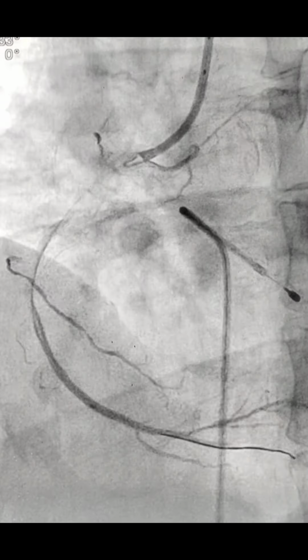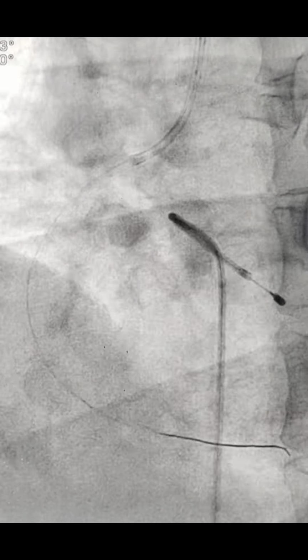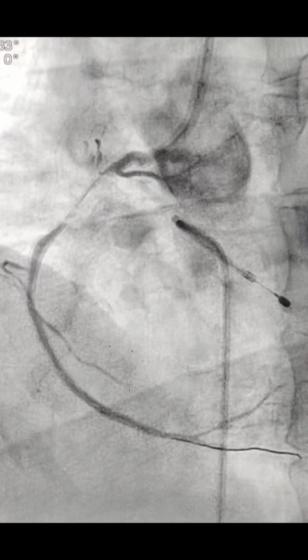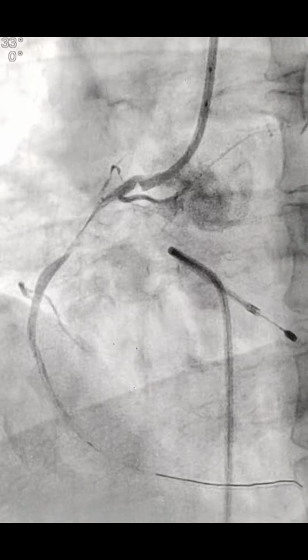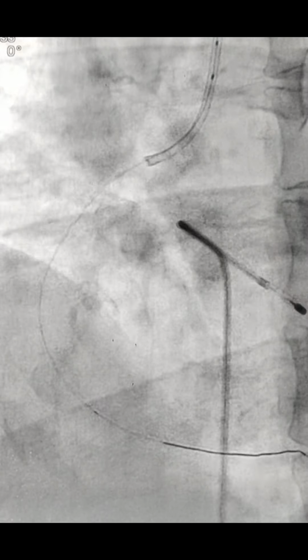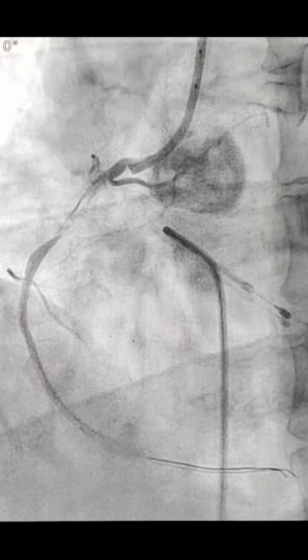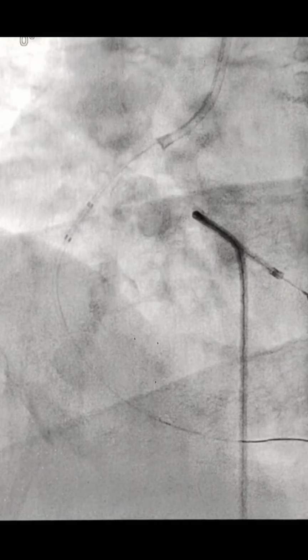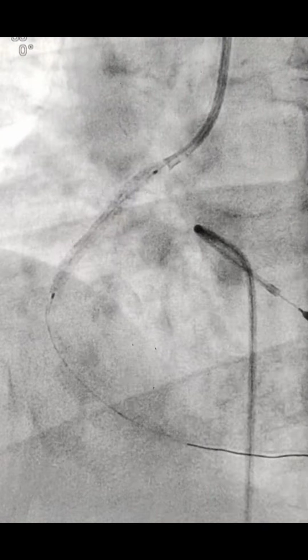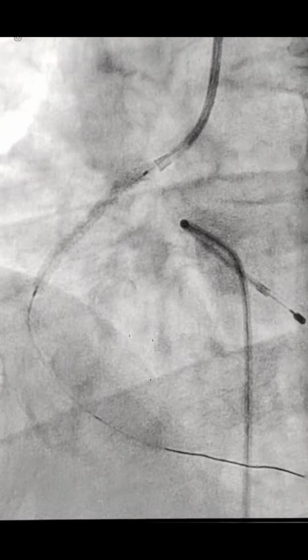So this is the picture after crossing the wire, and we tried to put a stent without predilatation, but the stent was not going in the proximal part, so we had to predilate the lesion. Because it was an acute condition, we didn't want to spread thrombus here and there with predilatation, but here we didn't have any option because the thrombus was organized, and then we predilated. This was a serial predilatation, and then we took a stent of 2.75 by 32, and from the ostium of the RCA we deployed the stent at 12 atmospheres of pressure.